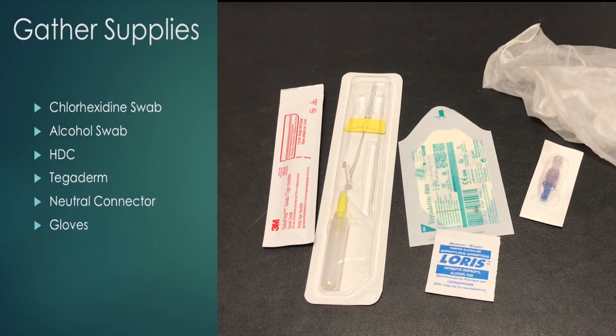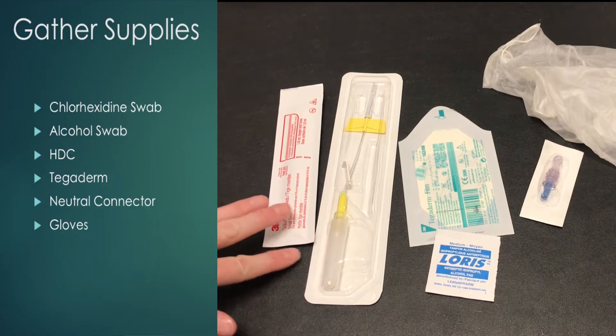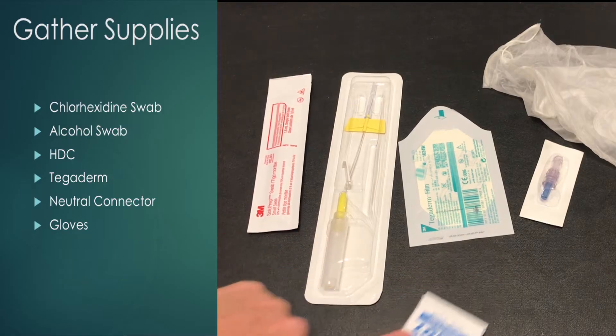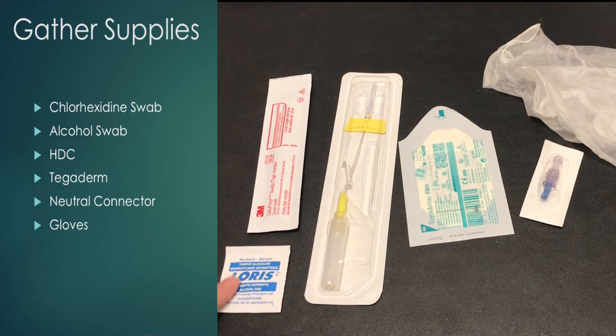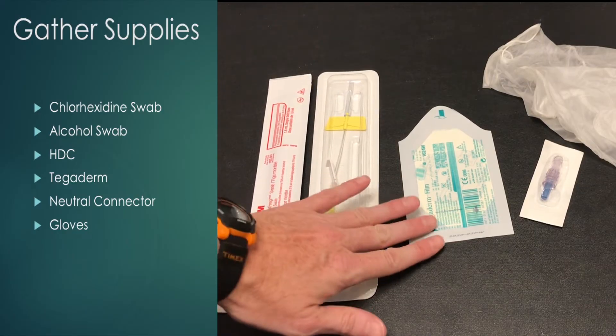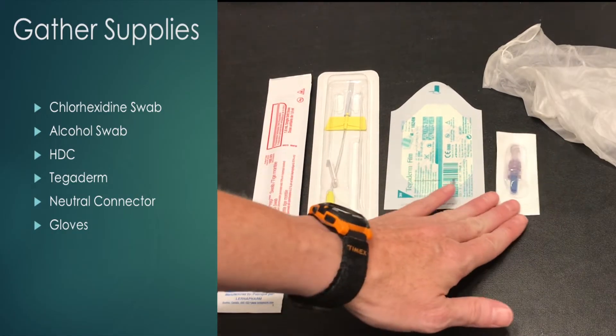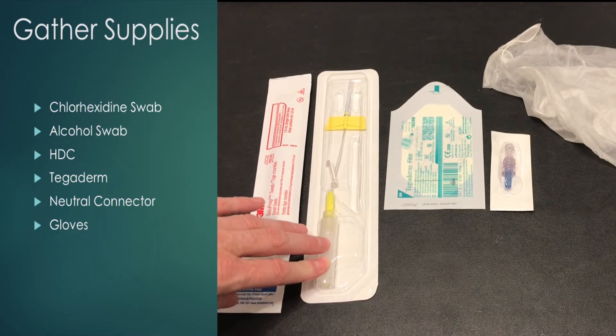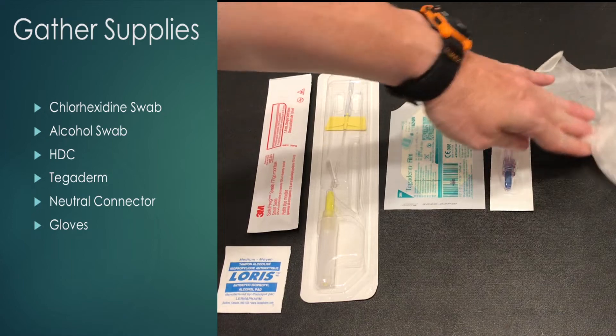In terms of supplies, we will need a chlorhexidine swab to clean the area for 30 seconds. If your patient is allergic to this, you can use an alcohol swab. We will need our catheter — our HDC — our tegaderm to secure it, a neutral connector to attach after we've pulled out the sheath, and of course your gloves.